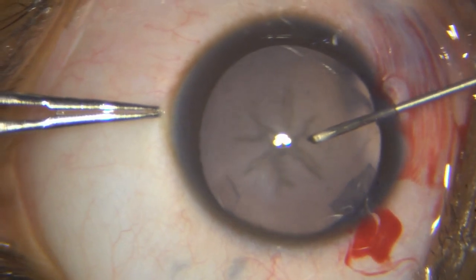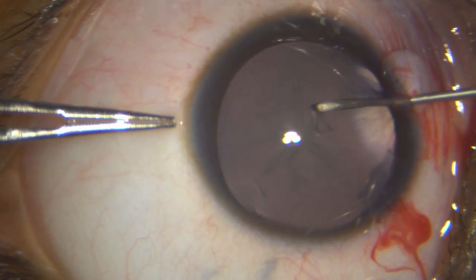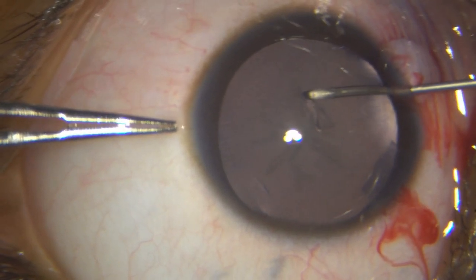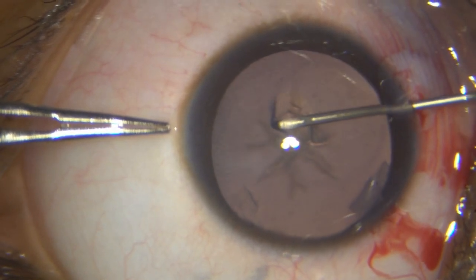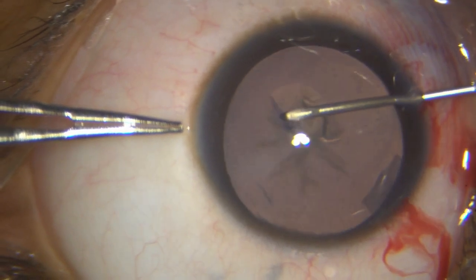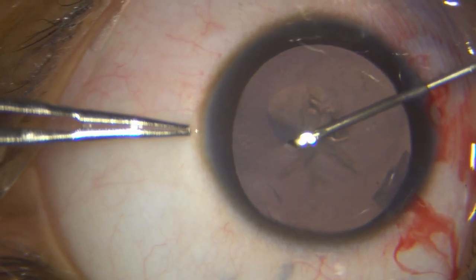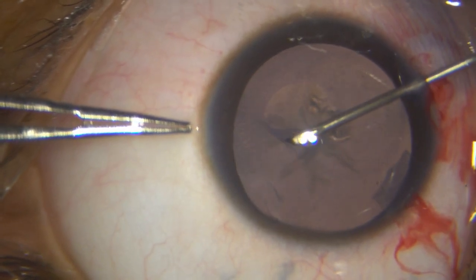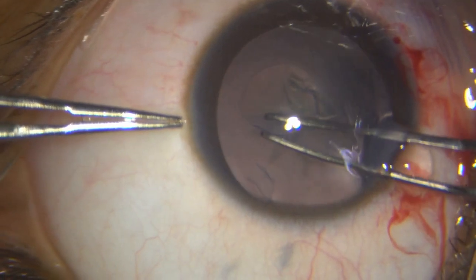I am fashioning my rhexis, initiating it with my 26-gauge needle. It is very important not to make the rhexis too big — you may either have it run away, or it will not overlap the IOL. So once I have initiated the rhexis, I take the utrata forceps, as this gives more control on this elastic capsule.